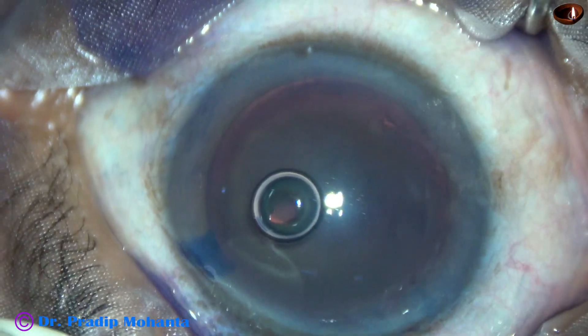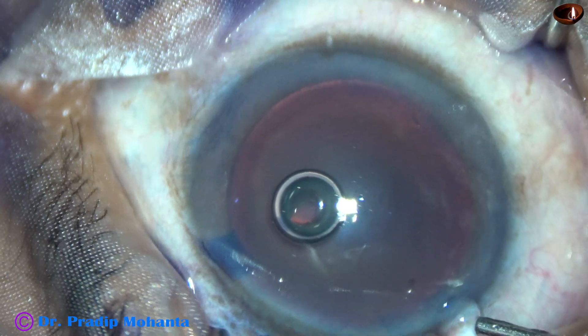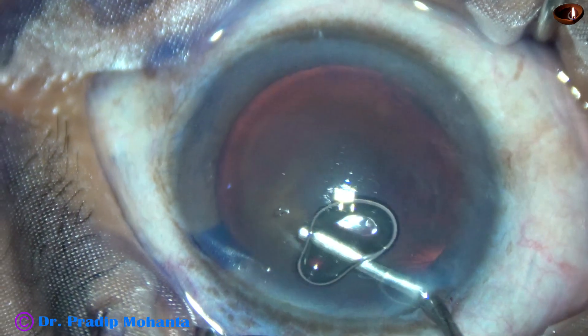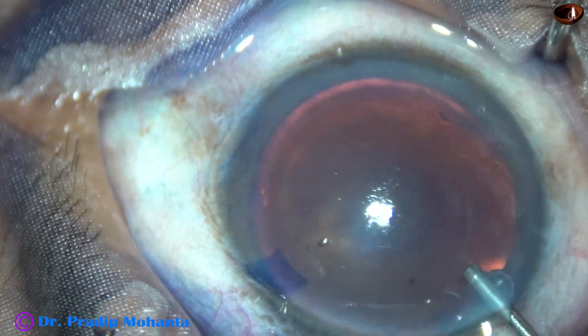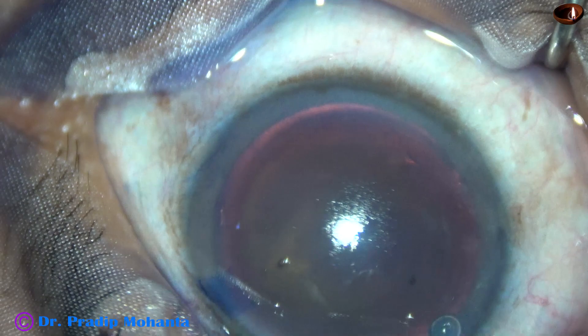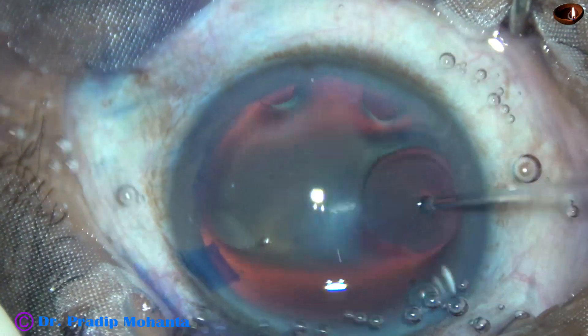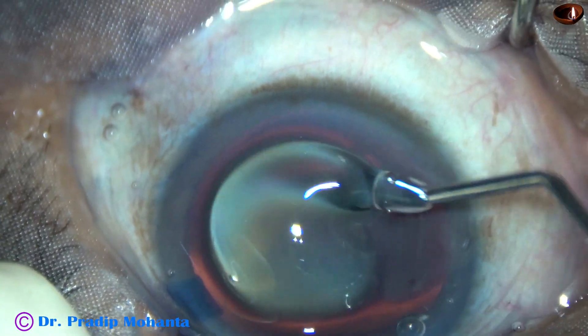Now, this is visco — 2% hydroxypropyl methyl cellulose — filling the anterior chamber. The visco is also applied over the cornea for better visibility.